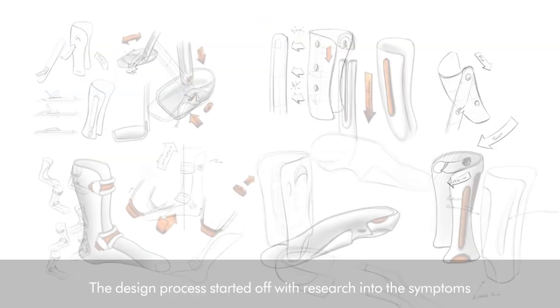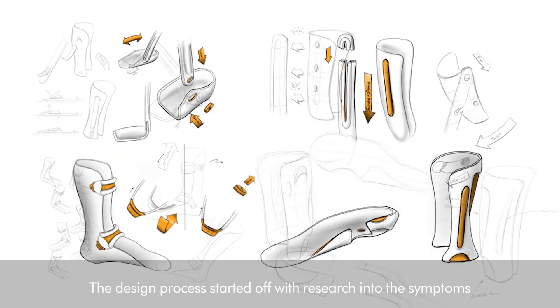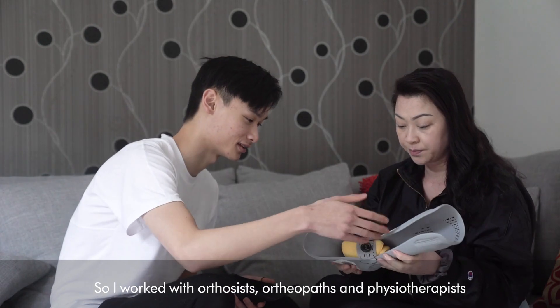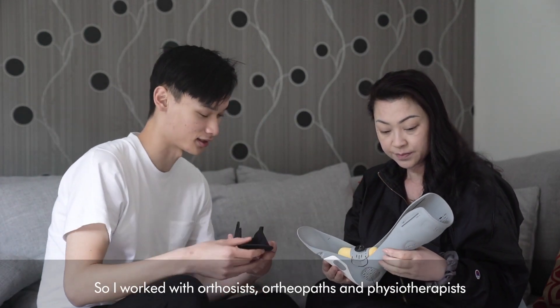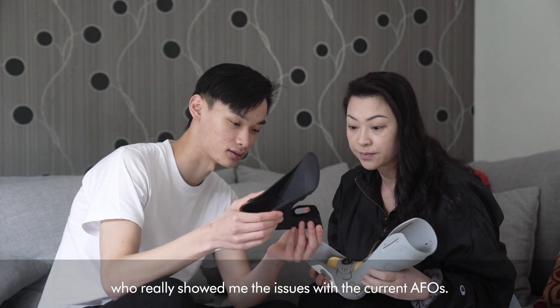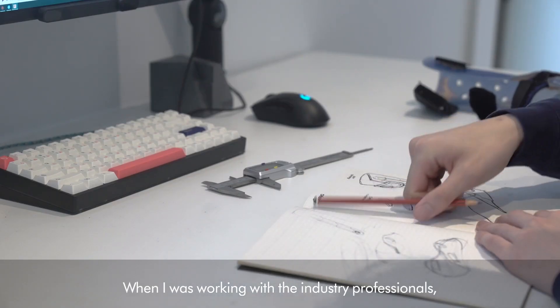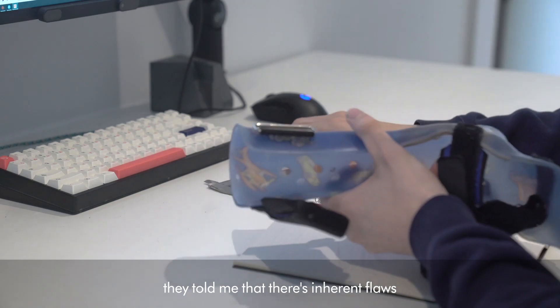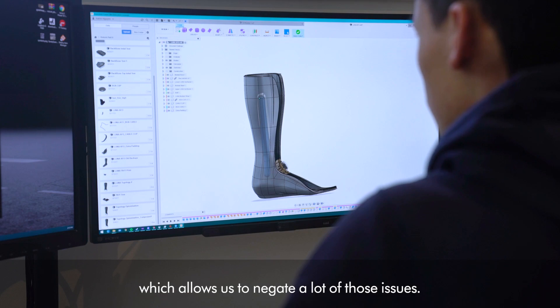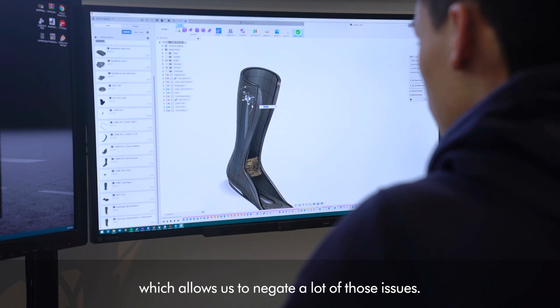The design process started off with research into the symptoms and the condition itself. I worked with orthotists, orthopaths, physiotherapists, and biomechanical engineers who really showed me the issues with the current AFOs. When working with industry professionals, they told me there are inherent flaws in the fabrication process, so we're using 3D scanning, which allows us to negate a lot of those issues.